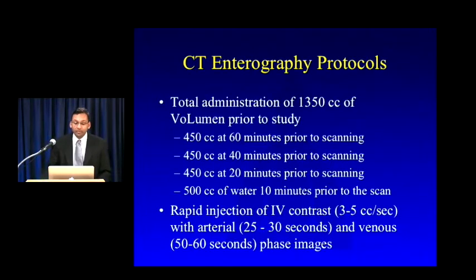Now, here's a good protocol that has been in place at Hopkins for our CT enterography protocols. And you can see that there's administration of 450 cc's of Volumen in 3 separate boluses: 60, 40, 20 minutes prior to scanning.